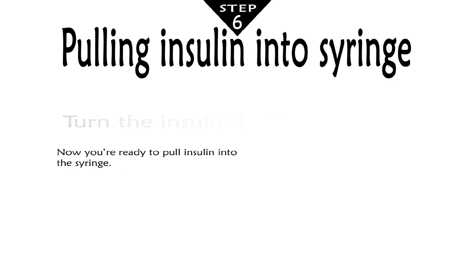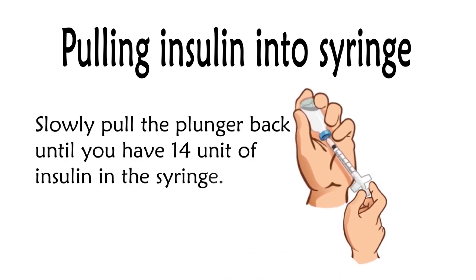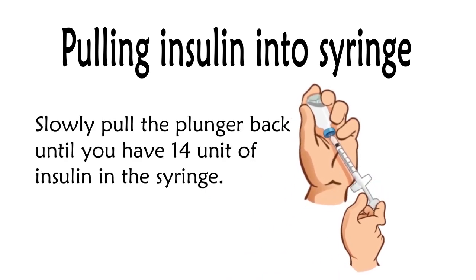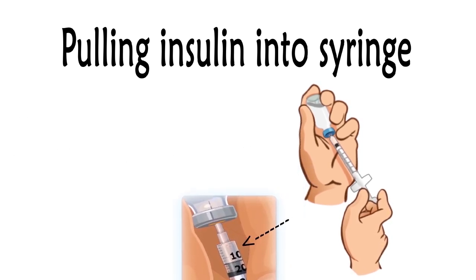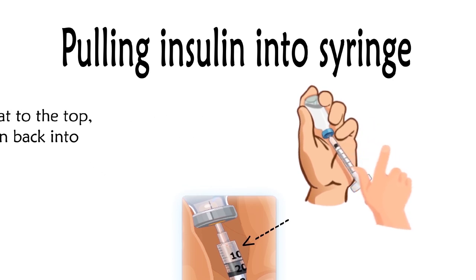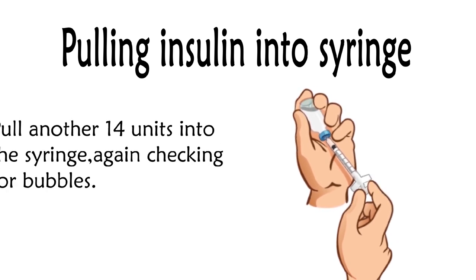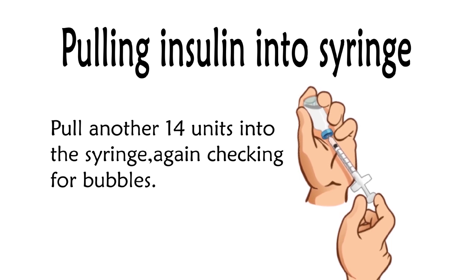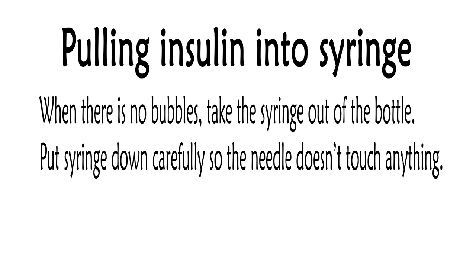Now you are ready to pull insulin into the syringe. Turn the insulin bottle and syringe upside down. Slowly pull the plunger back until you have 14 units of insulin in the syringe. Check the syringe for air bubbles. If you see any, hold both the bottle and syringe in one hand and tap the syringe with the other hand. The bubbles will flow to the top. Then push the insulin back into the bottle and again pull another 14 units into the syringe. Check again for bubbles. When there are no bubbles, take the syringe out of the bottle. Put the syringe down carefully so the needle does not touch anything.